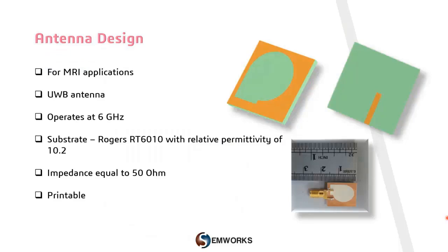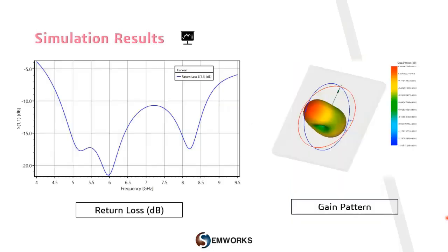So the design strategy here is to start with a basic single antenna element that operates at 6 GHz. It consists of a P-shaped slot radiator etched out of the ground plane on one side of a dielectric substrate. HFWorks is used to investigate and study this antenna.